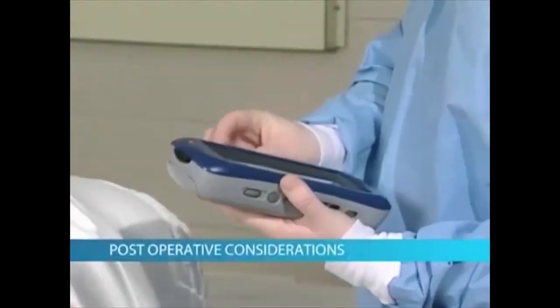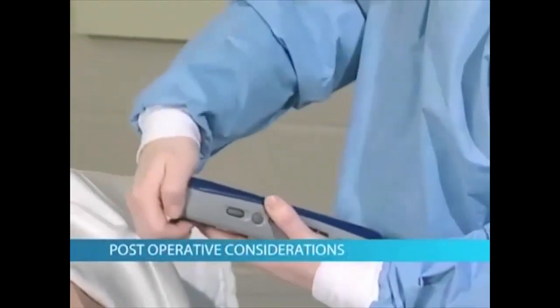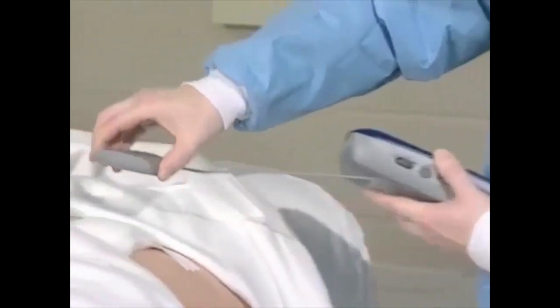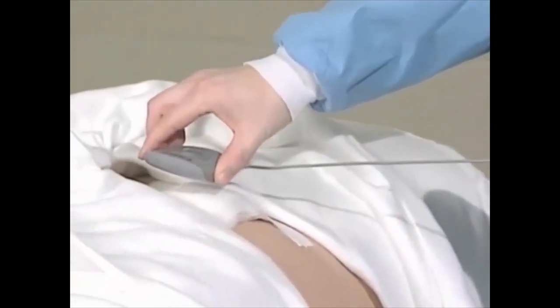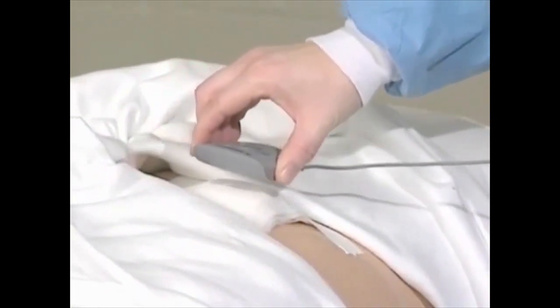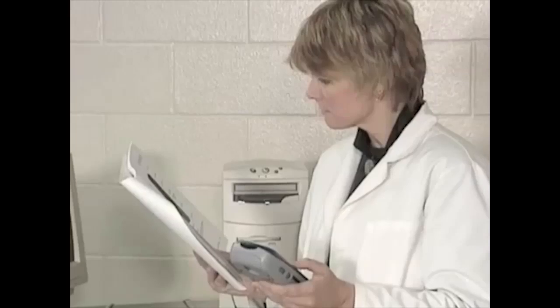Immediately following the implant procedure, program the pump with the priming bolus and the patient's prescription drug dose. Ideally, this will be done in the OR, so that all catheter and pump information is accurately entered into the programmer for future use. For detailed instructions on programming, please refer to the SynchroMed 2 programming guide.